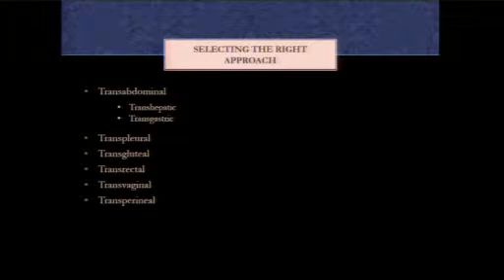epigastric vessels. If you're going retroperitoneally, you want to avoid the vessels, obviously, but you also want to avoid the ureter. Sometimes if you're worried that you're near the ureter, you can use contrast administration and wait for the urographic phase, and that'll opacify your ureter so you can avoid it. You can also sometimes pass through the psoas, but it's important to remember that the genitofemoral nerve passes anterior to the psoas muscle, so the patients can experience quite significant groin pain if you hit that structure, so just try and avoid the anterior psoas if possible.